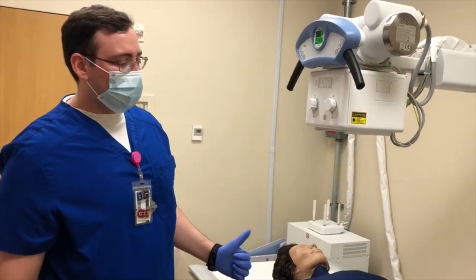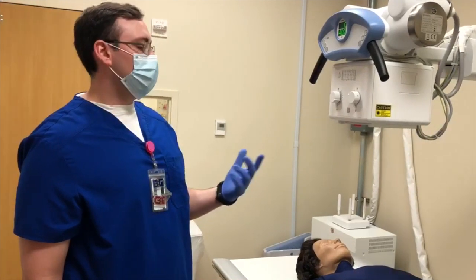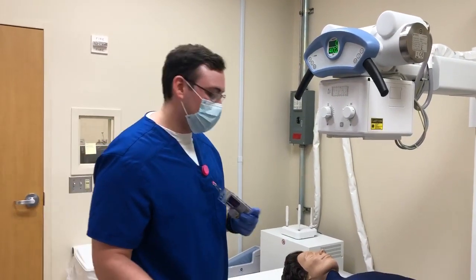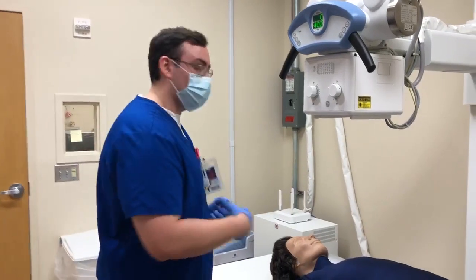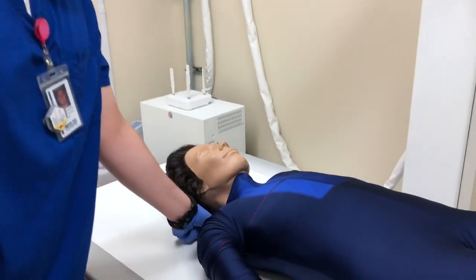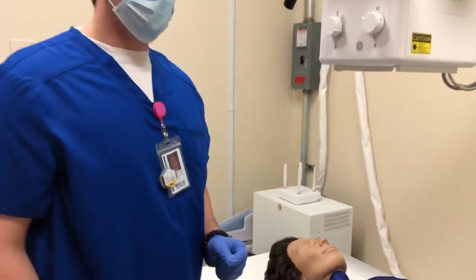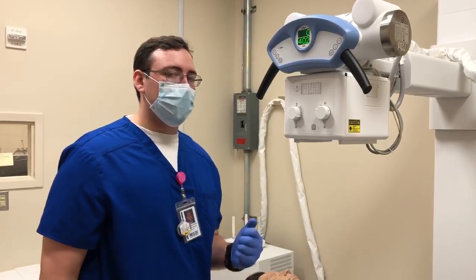and you expose on expiration, so you tell them to breathe in, breathe out, hold it, expose. Another thing to know is do not make the same mistake I did. You also have to put a marker on. So this is the right side of the patient, so we're going to put a right marker in here. And make sure you don't get it in the anatomy, just in the light field right there. And then you would go ahead, tell the patient to take a deep breath in, breathe out, hold it, and then get the x-ray image.